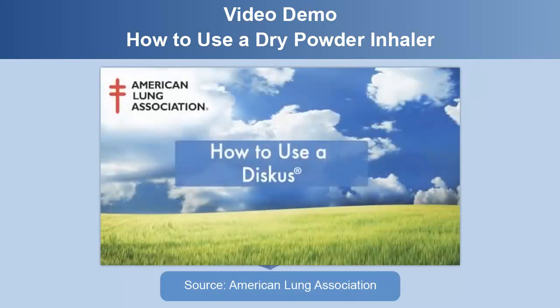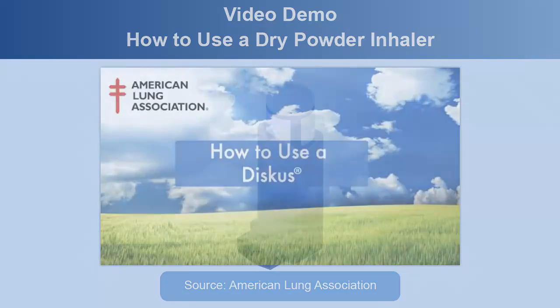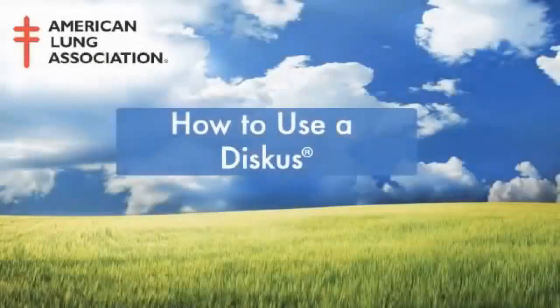Next, we're going to watch a video from the American Lung Association. This video shows how to use a dry powder inhaler. How to use a Diskus. This video is brought to you by the American Lung Association.